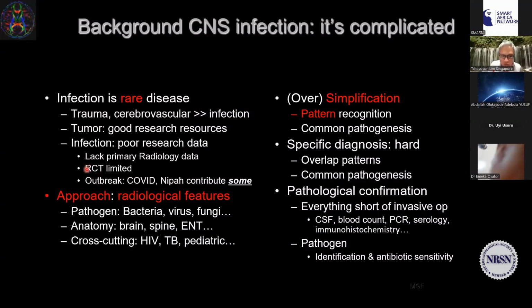Randomized controlled trials are very, very few. However, I have had the good luck or the bad luck of being involved in outbreak CNS imaging, such as SARS, Nipah virus, and of course, COVID. During COVID, CNS imaging in COVID patients contributes somewhat, but it very often ends up confusing many radiologists.